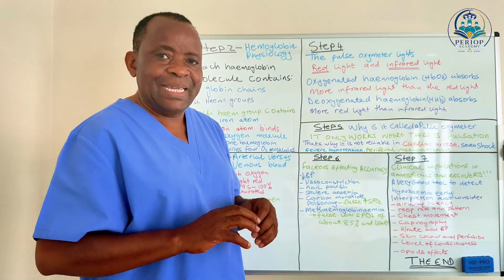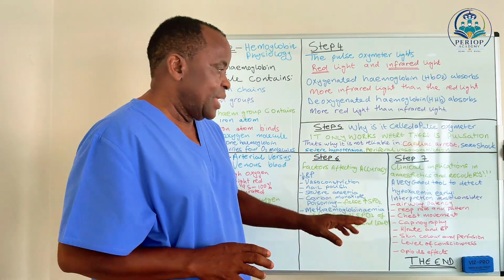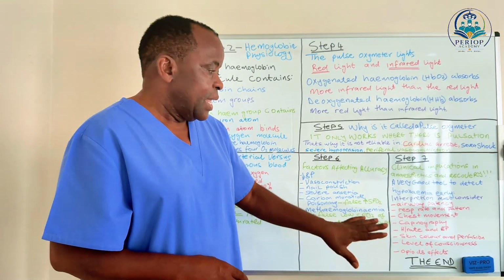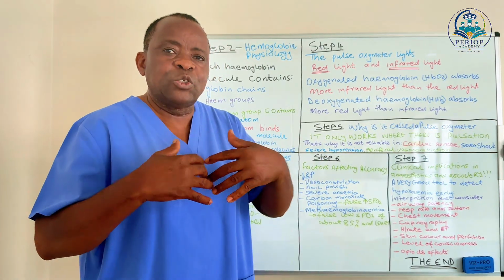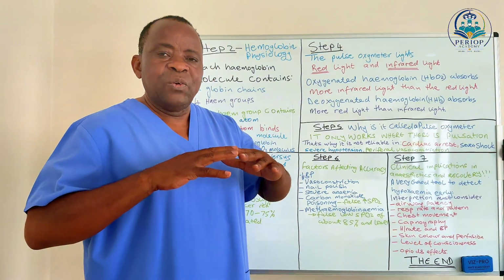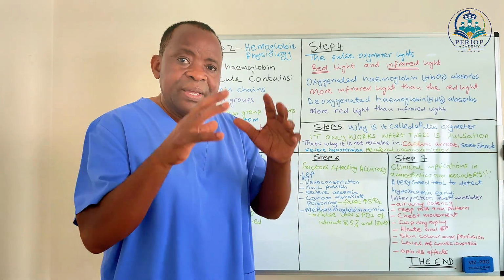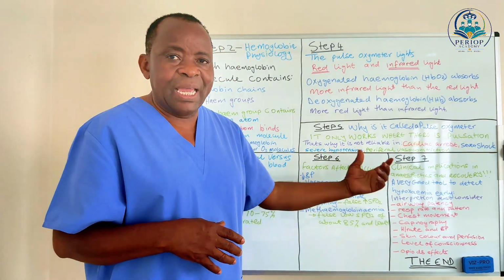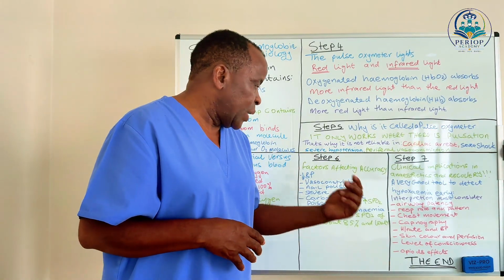Lastly, the effects of anesthetic drugs and opioids, as they are being looked after in theater and recovery, also have an implication on the pulse oximetry evaluation. So understand the drugs which have been used, which tend to reduce the respiratory effort, which tend to reduce the blood pressure, which tend to reduce the heart rate and things like this. As long as you know these issues, you are effectively applying your skills and knowledge in relation to pulse oximetry and how it works.